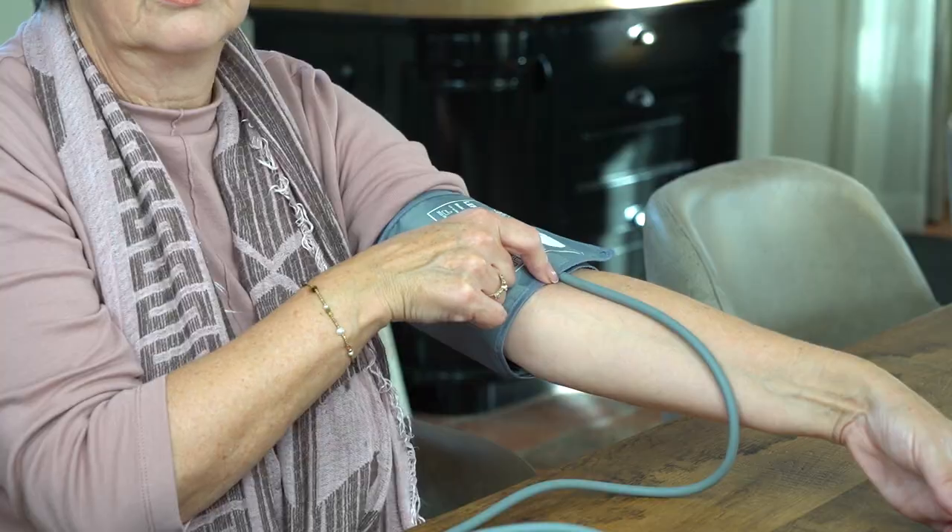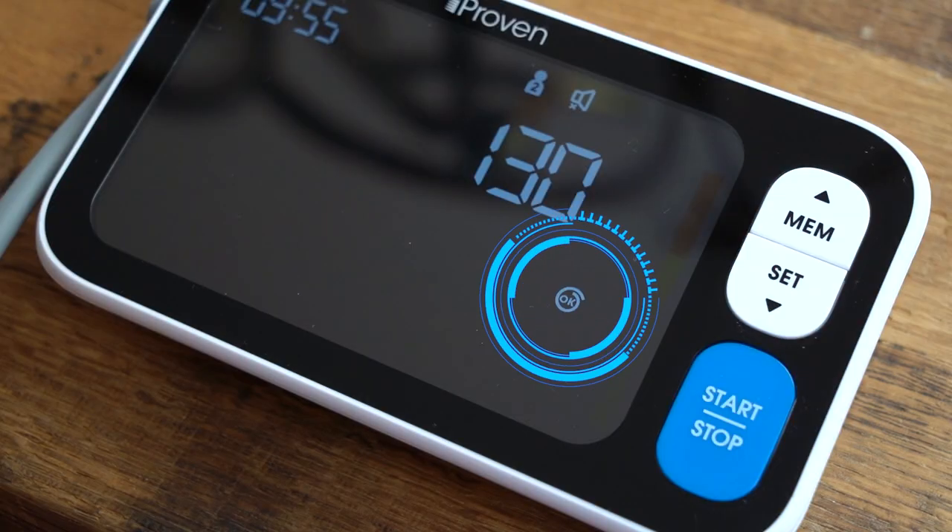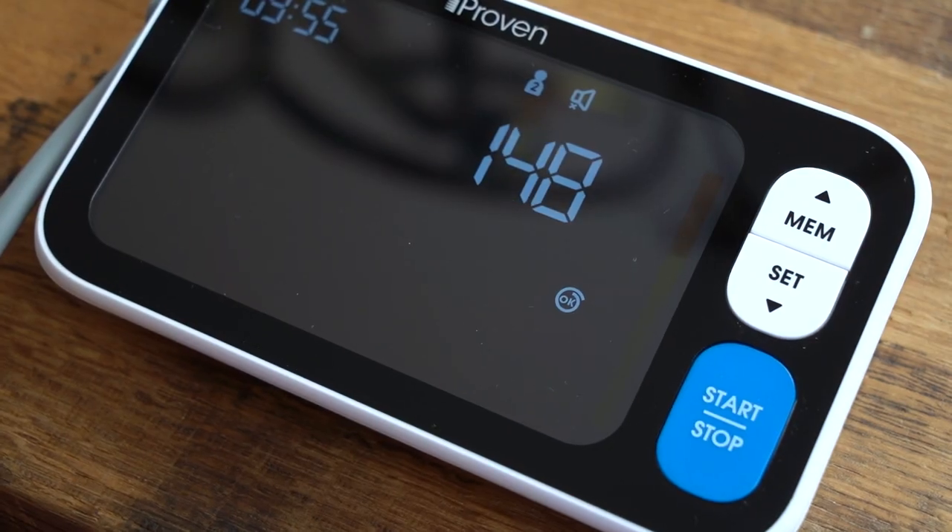During inflation, the OK sign will let you know if the cuff is correctly positioned. The motion detector will automatically interrupt the reading if you move your arm, to prevent inaccurate readings.